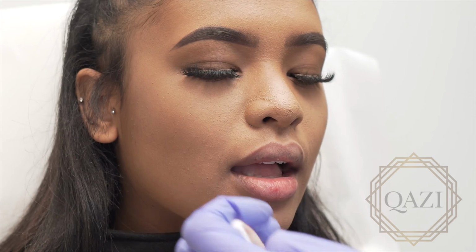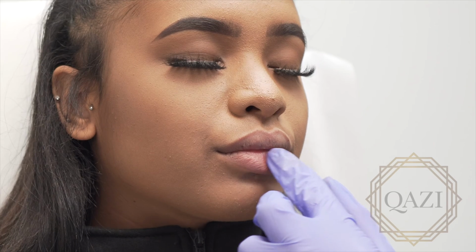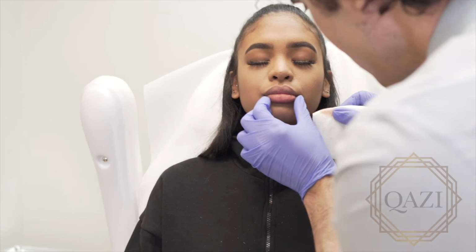For this patient, I am using the newer filler, Revanesse Versa, because it doesn't cause as much swelling as some of the other fillers. And this patient already has some very nice large lips. We don't want to cause them to be excessively large.